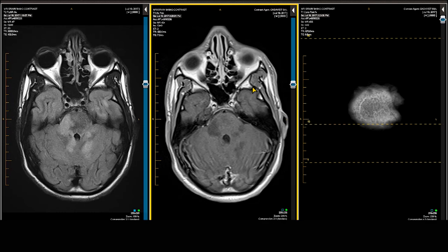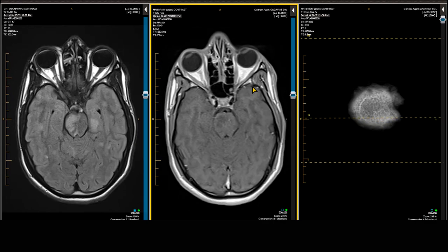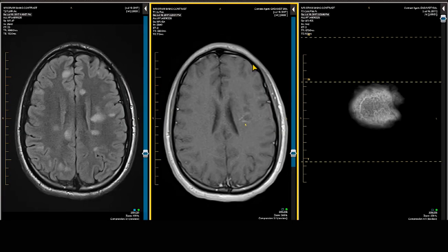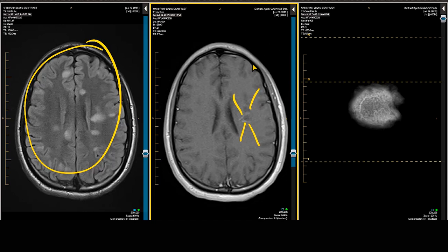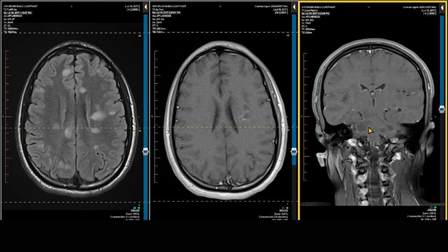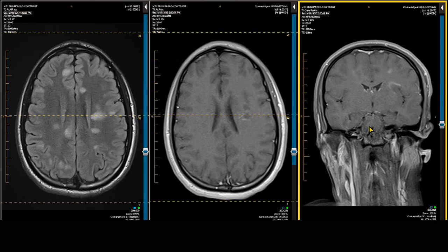As we scroll, much of what is seen in the brainstem and cerebellum is not showing contrast enhancement. However, as we get further superior, we come across a lesion in the left corona radiata showing bright signal intensity enhancement on the T1-weighted post-gadolinium scan. Based on the FLAIR images alone there is no way to know which plaque will show contrast enhancement, but the T1 post-gad reveals this plaque to be active. Correlating with the coronal scan verifies the contrast enhancement in that left-sided plaque.